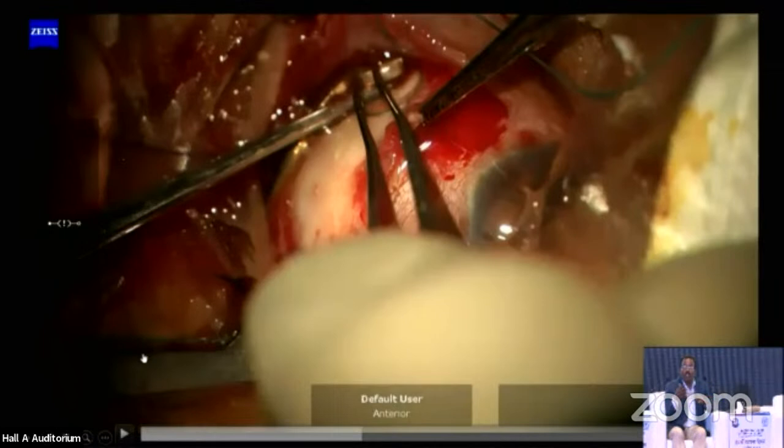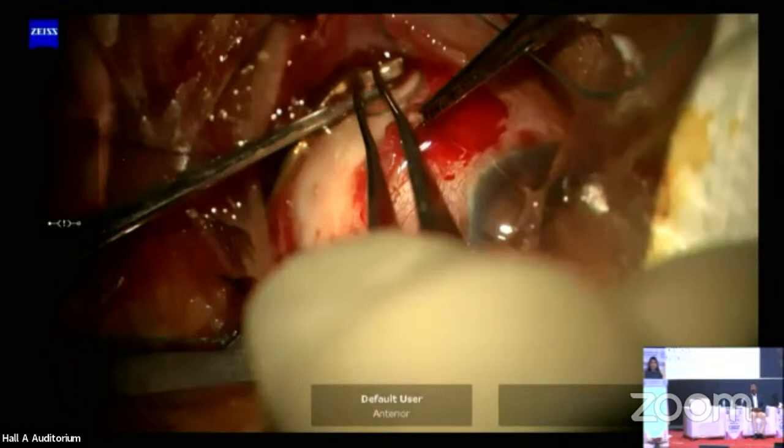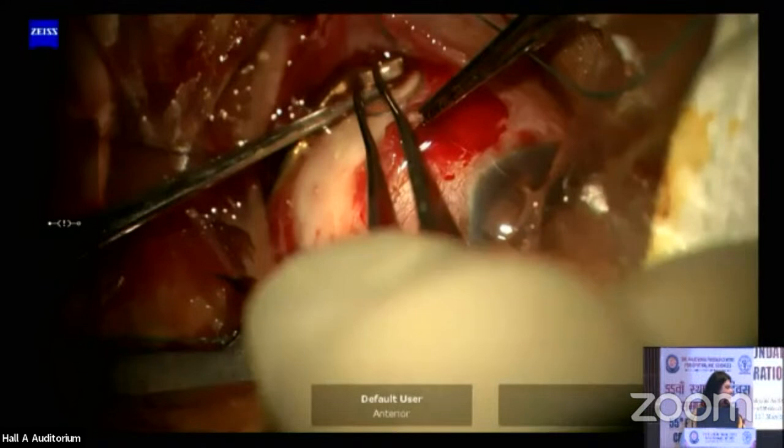Thank you very much. There are iodine plaques, and I know that across the US, iodine plaques are being used. Over there, the surgeons operating in the operating room actually wear lead aprons while they perform the procedure. But here, because we're using ruthenium plaques, which emit beta radiation, we're not exposed as much as the surgeons using iodine plaques are. Therefore, we just have those badges that we wear during surgery. Would you like to elaborate a little bit about those badges?